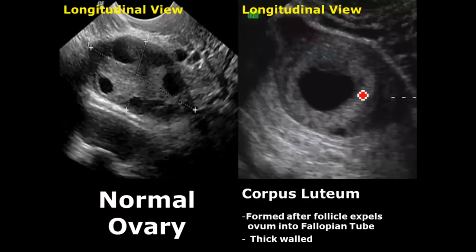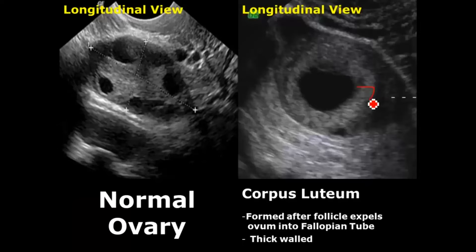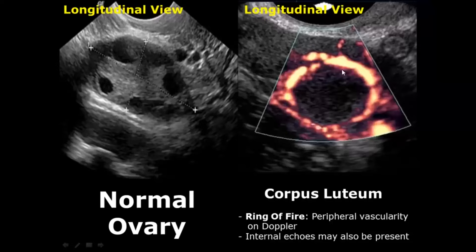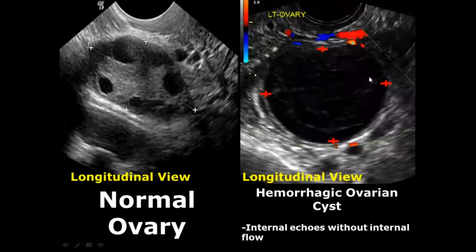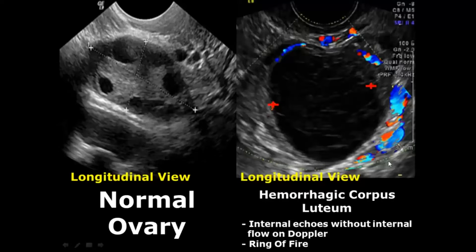Corpus luteum is formed after the ovum is expelled into the fallopian tube — it is a thick-walled structure. On Doppler, we observe peripheral vascularity called the ring of fire, and there can also be internal echoes inside the corpus luteum. A hemorrhagic ovarian cyst can occur from rupture of a corpus luteum or any other functional cyst — it has internal echoes due to blood products and absence of flow on Doppler.